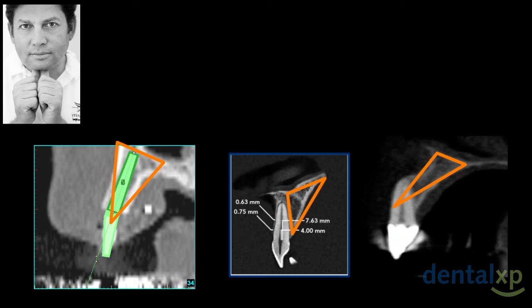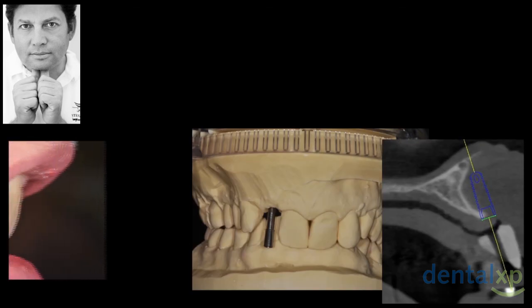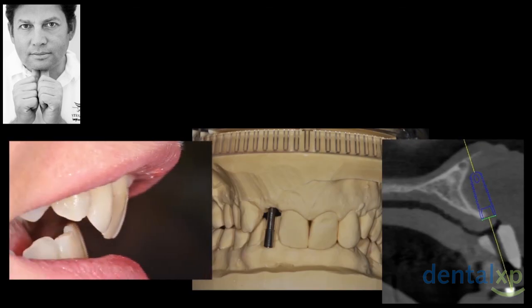Now, when you extract the tooth and you only have your CBCT and you're going to follow the bone, that's another digitally induced disease, like others. And what you can see here, this is a situation where we have often. So let's share a case. See, this is a case with a deep bite.